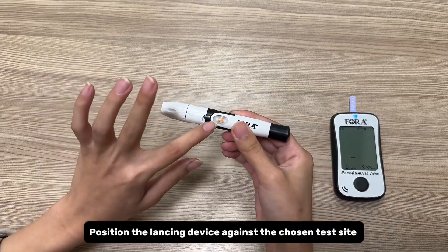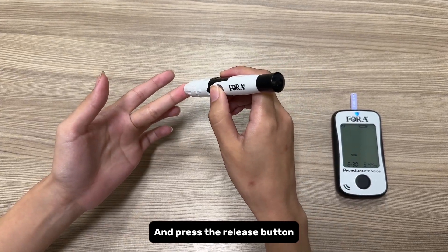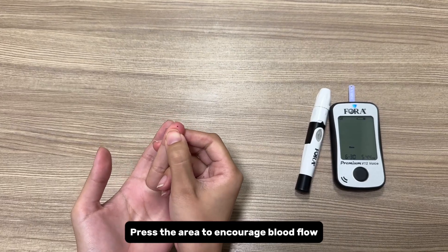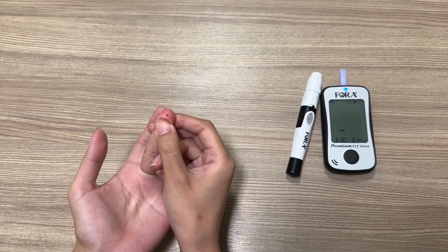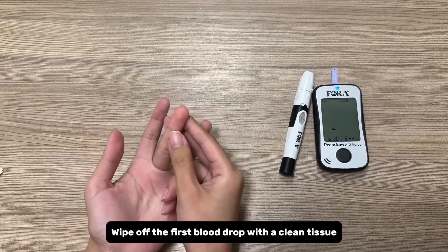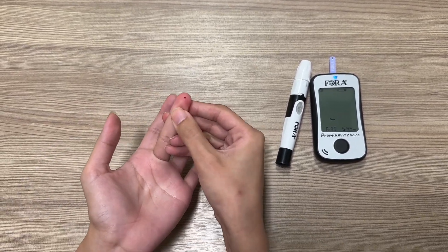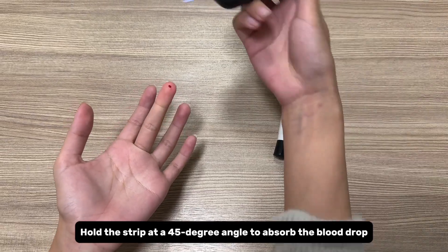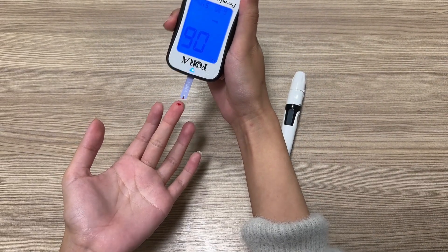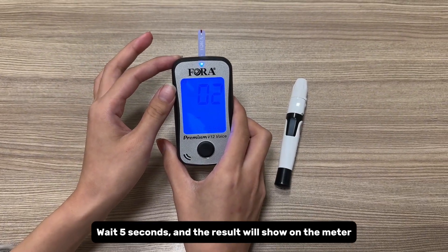Position the lancing device against the chosen test site and press the release button. Press the area to encourage blood flow. Wipe off the first blood drop with a clean tissue and use the second drop for testing. Hold the strip at a 45-degree angle to absorb the blood drop. Wait five seconds and the result will show on the meter.